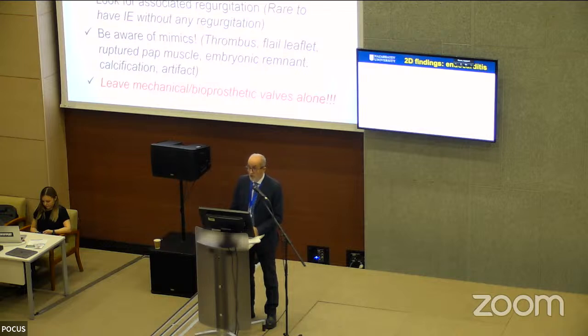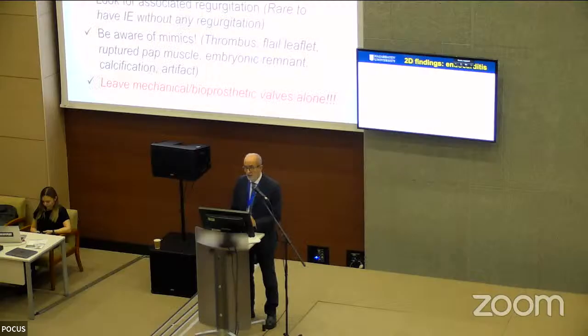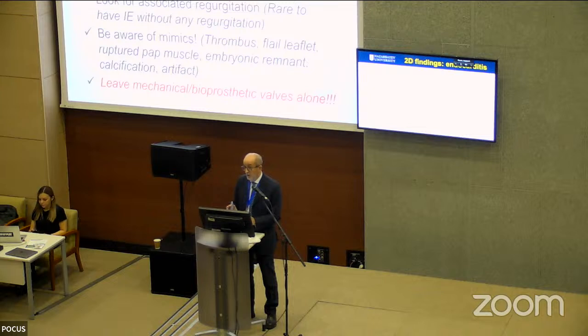And remember, when you have a valve prosthesis, leave it alone. POCUS is not the best method. You always need something different, more accurate, more reliable. So don't take any decision in patients with a mechanical or bioprosthetic valve.